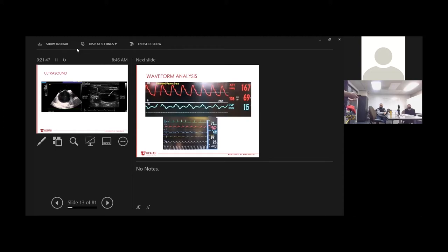But again, if you guys are in this chaotic situation, you're not sure where it is, you can ask an ED doc, hey, can we double check with the ultrasound? Can you pull a probe on him and I'll flush it? Again, you guys need to be recommending ways to confirm it if they haven't done so.